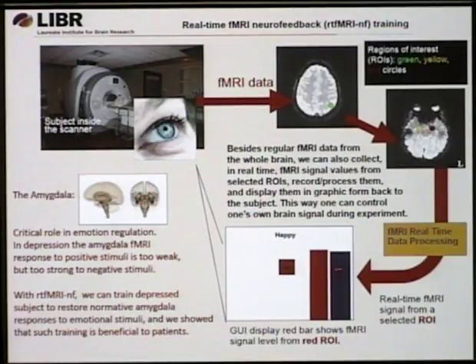And you can think about the application of this neurofeedback for many other things. Lots of people are now running neurofeedback experiments and trying to use this to enhance cognitive ability, to enhance memory, and for different psychiatric diseases, essentially using different brain regions. It's a very hot research topic right now. But this is actually what fMRI can be used for. Essentially, we can really put you in control of your own brain with this technique.